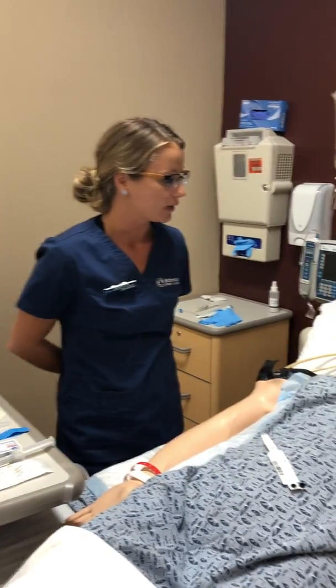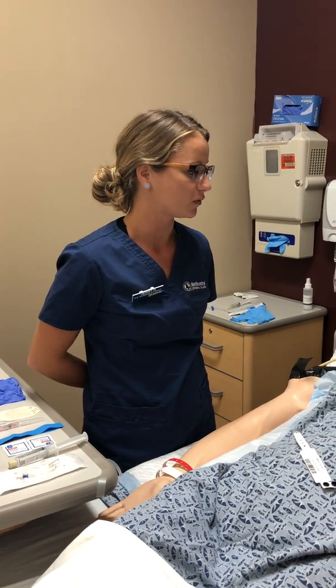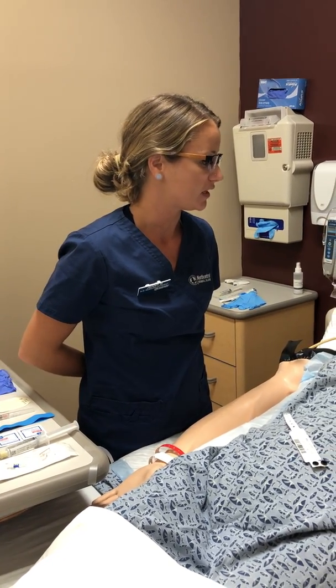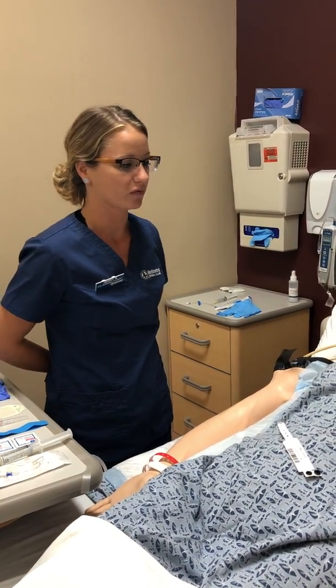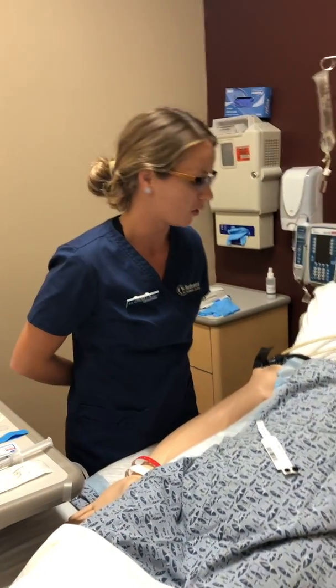Mary, I am here today because your doctor had put some orders in for us to start you on some IV fluids, which will help take care of your dehydration and rehydrate you. And so that means that I need to insert an IV catheter into your arm. Have you had an IV in before? And she tells me that she has had one before. I asked her if she had any issues when she had that, and she said no, that she did not have any issues.